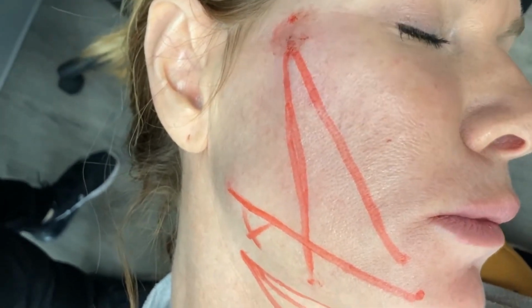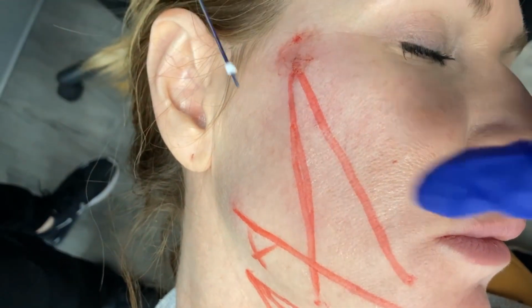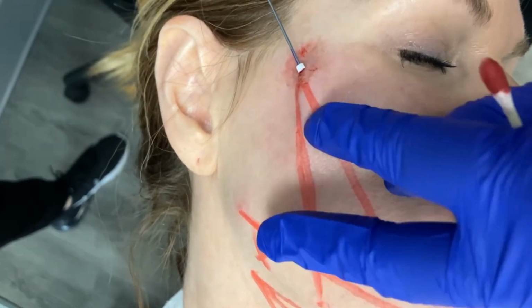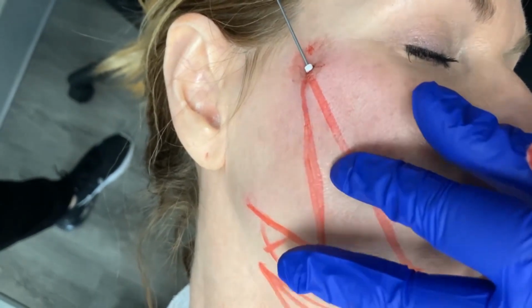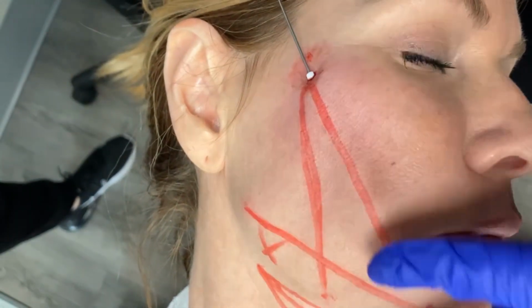Now you're giving just a tiny bit of lidocaine, enough to get anesthesia. You don't want to flood the area, because this lifting thread that's going in now is going to need to attach to that SMAS, and if there's too much fluid, then it will not be as effective here. We are using a V-Soft Lift lifting thread. These are the best, and that's the reason we only need 2 of them. These are the strongest by far.